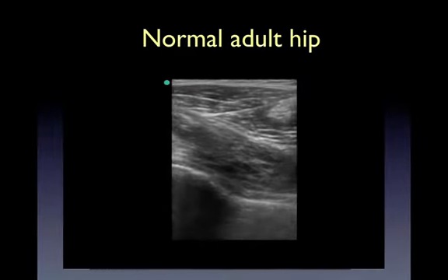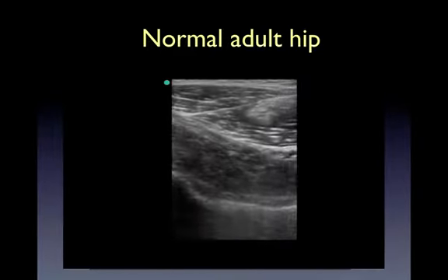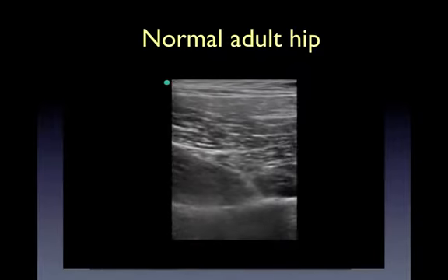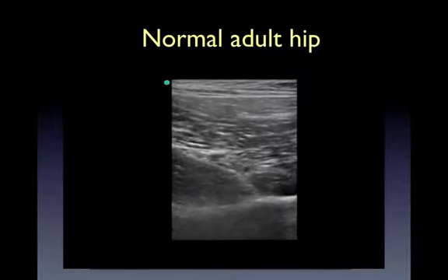In this clip, we see a normal adult hip. Note the absence of the growth plate.